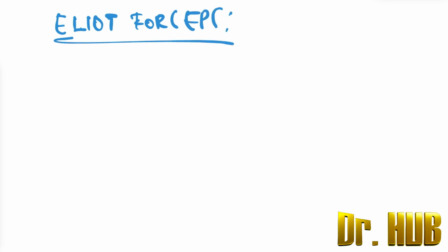Next, we'll move on to the Elliott forceps. So this is Elliott forceps. How does the diagram look? It is similar to that of the Simpson's forceps, but here there is no U-shape above the handle.